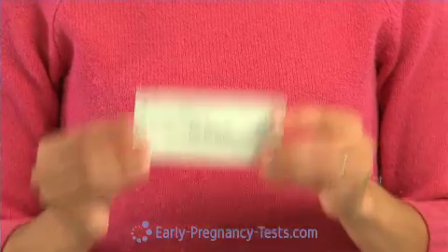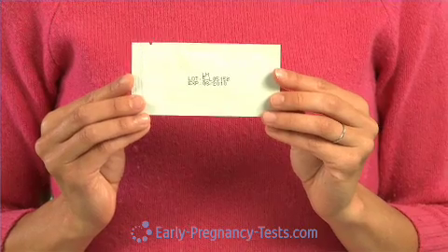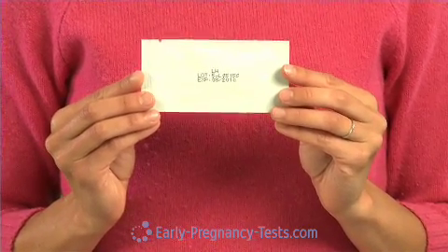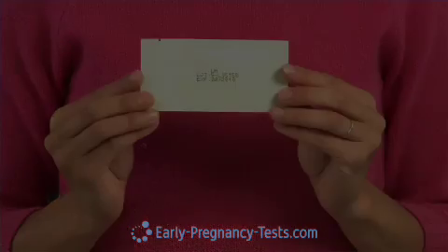In this case, LH, which is the hormone detected in an ovulation test. The lot number and expiration date are also printed on the pouch. When you buy ovulation tests at EarlyPregnancyTest.com, you can expect to have an expiration date approximately two years from the purchase date.